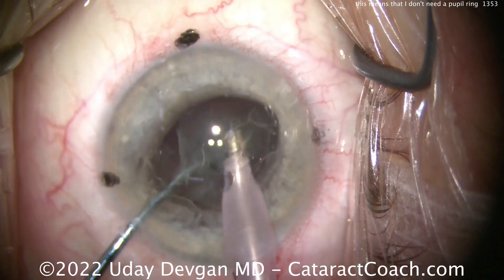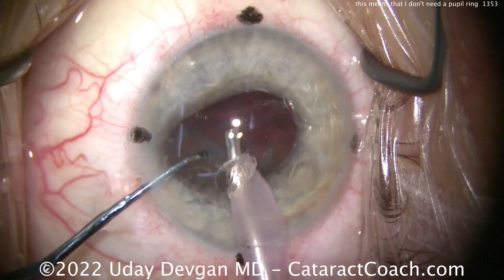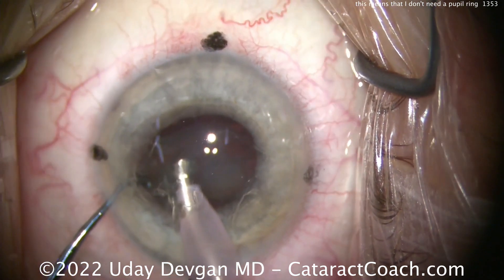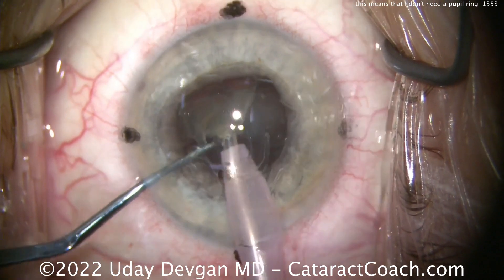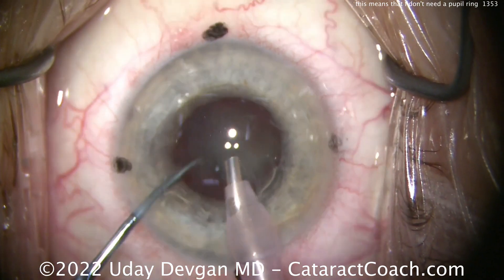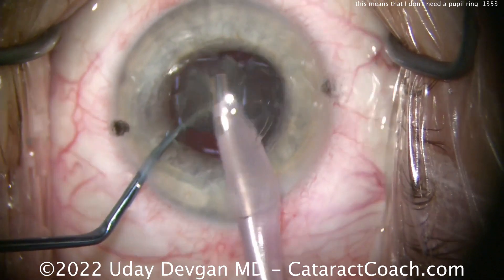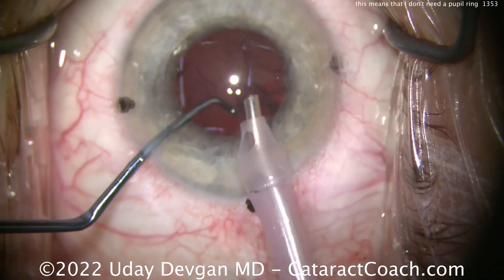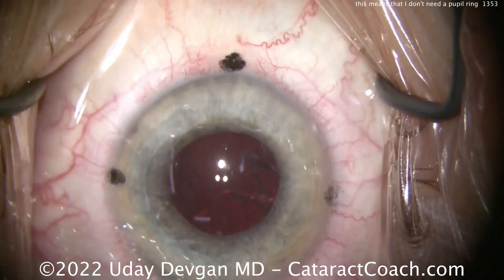All we've got to do is emulsify that first half and take it out. Notice how I'm operating at the iris plane and staying centrally. Once the first half is out, we push over the second half and do the same thing. The pupil may come down further in this case, and that's to be expected — the patient is a Flomax patient using Tamsulosin, and that's going to cause this pupillary miosis and that floppy iris as well. We get the nucleus out, pretty much cleaned up, and we're just about ready for the IA probe.